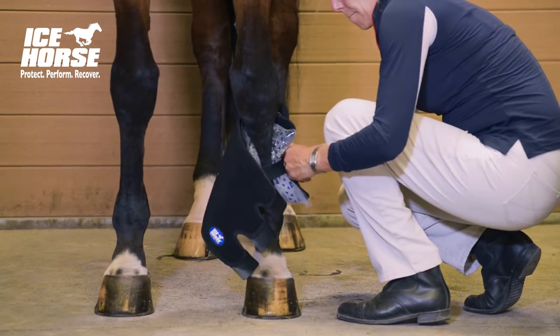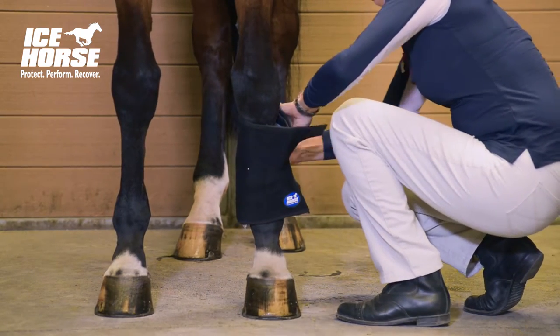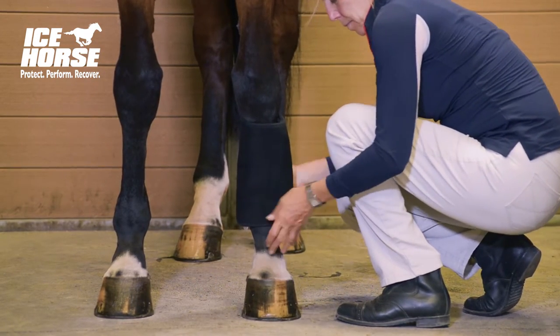Place the wrap around the horse's leg and fasten the inner strap. Next, pull the outer strap around the horse's leg and fasten starting with the middle, then the bottom, and ending with the top.